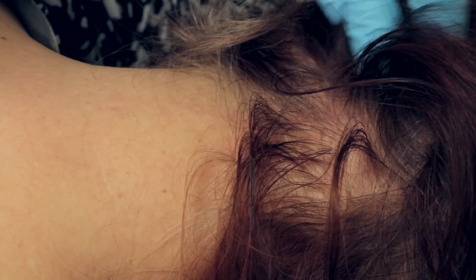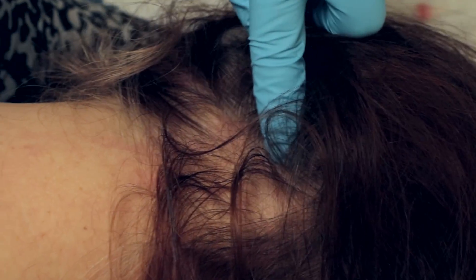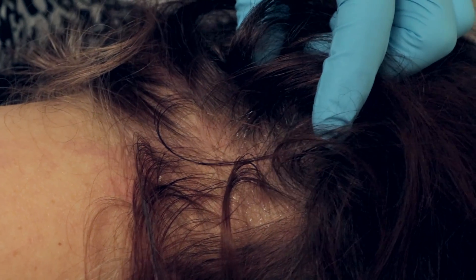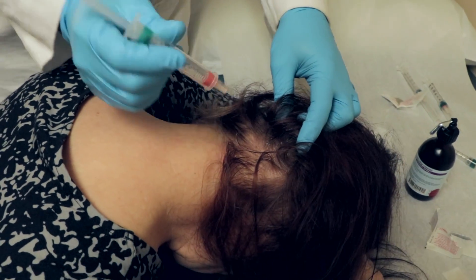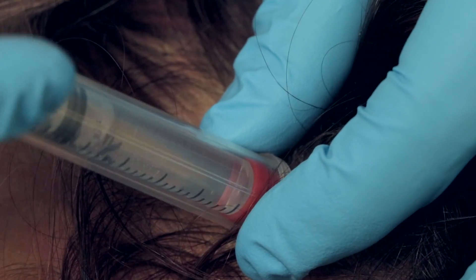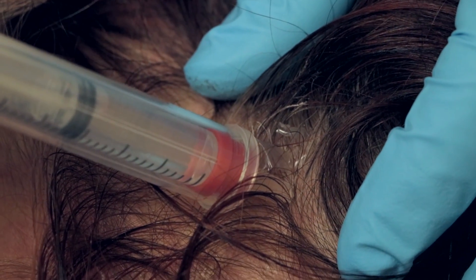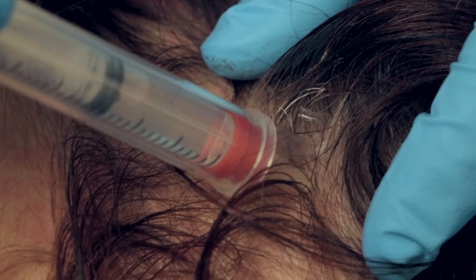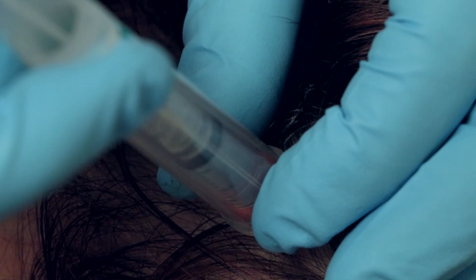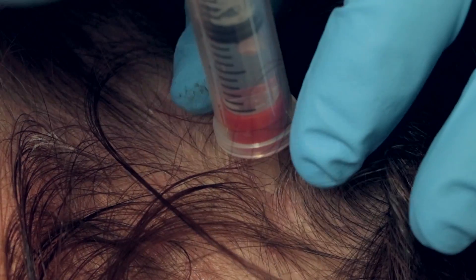I find the prominence again, and then go just lateral to it — right there, yes, that is it. The reason I know where to go is just how far it is — just a centimeter, less than a centimeter over from midline. Drawing up and injecting. She's feeling it more than the other two. She mentioned it was going down the back of her neck — and now with the injection, there's just less pain going down the neck.